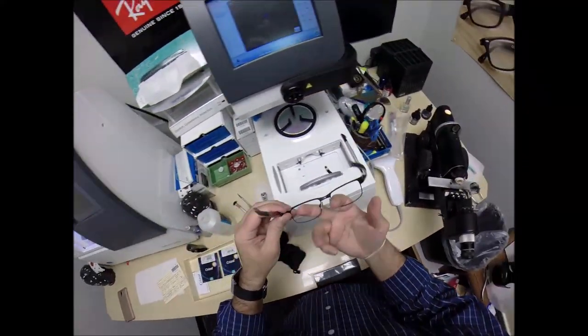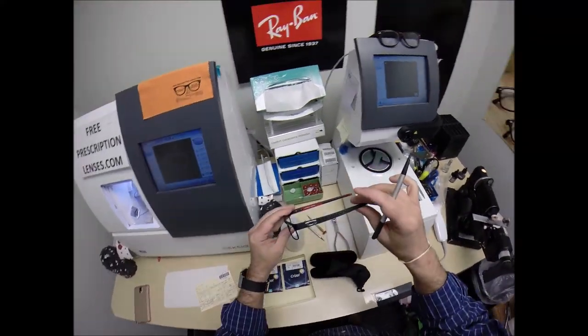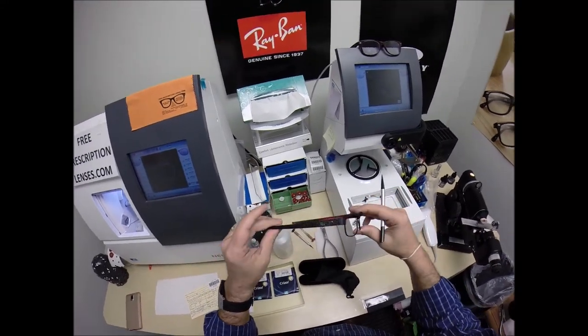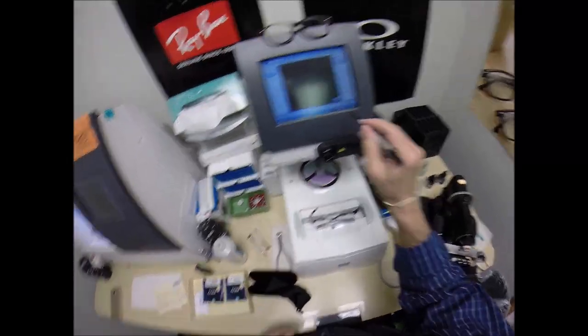It is the Oakley 5079 Carbon Plate in color 01, the matte black. It's got the carbon plate written on there. Normally I would pop out the original demo lenses. They do not come with this frame. Although I've got to tell you, Justin, this frame looks brand new. When they say gently used, boy, was it ever. So I've never seen a used frame in such good condition.